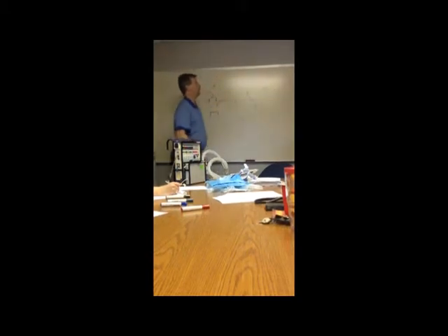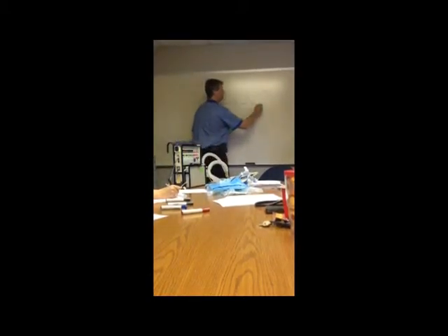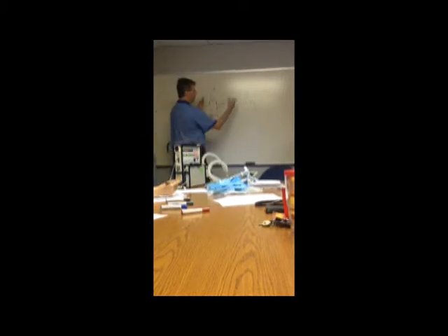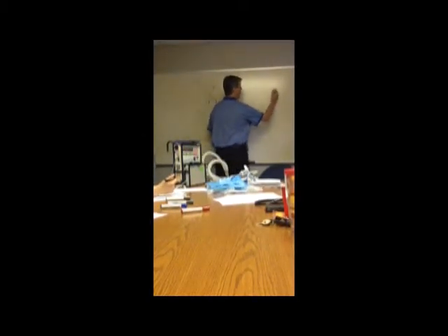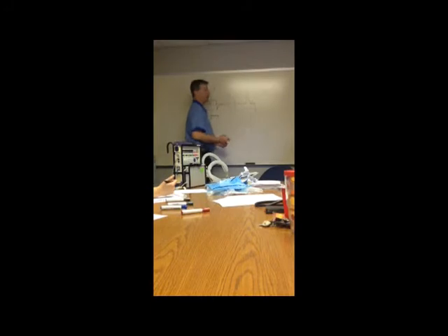All right. The control part in this is what ends the breath. That determines what type of breath it is. All right, there's the breath pattern, which determines the mode, and then the kind of breaths that are in the pattern are pressure control, volume control, pressure support. Those are breath types. So you mix the pattern with the breath type, and that gives you what we call modes of ventilation.